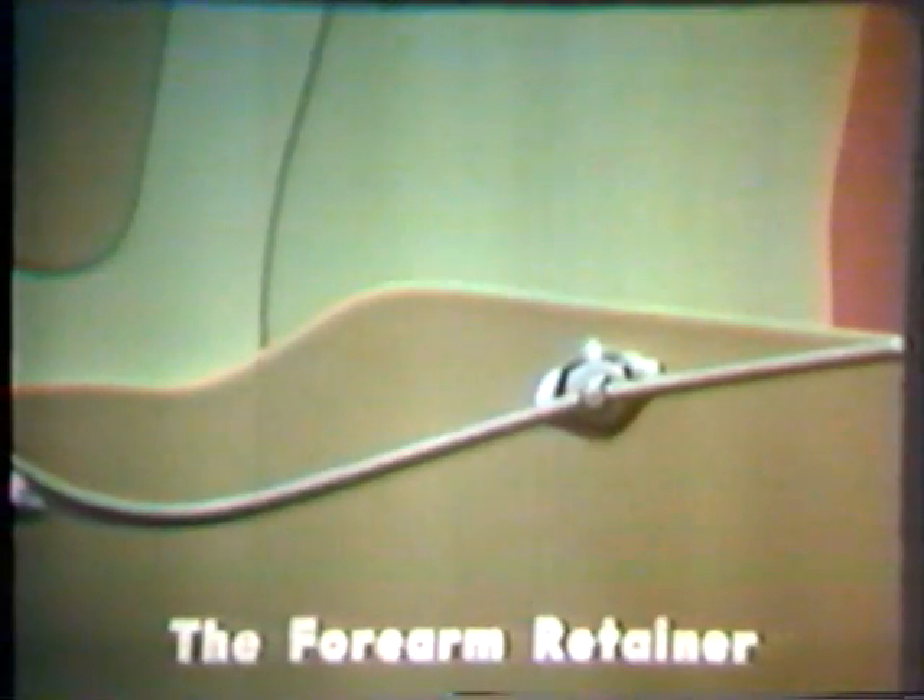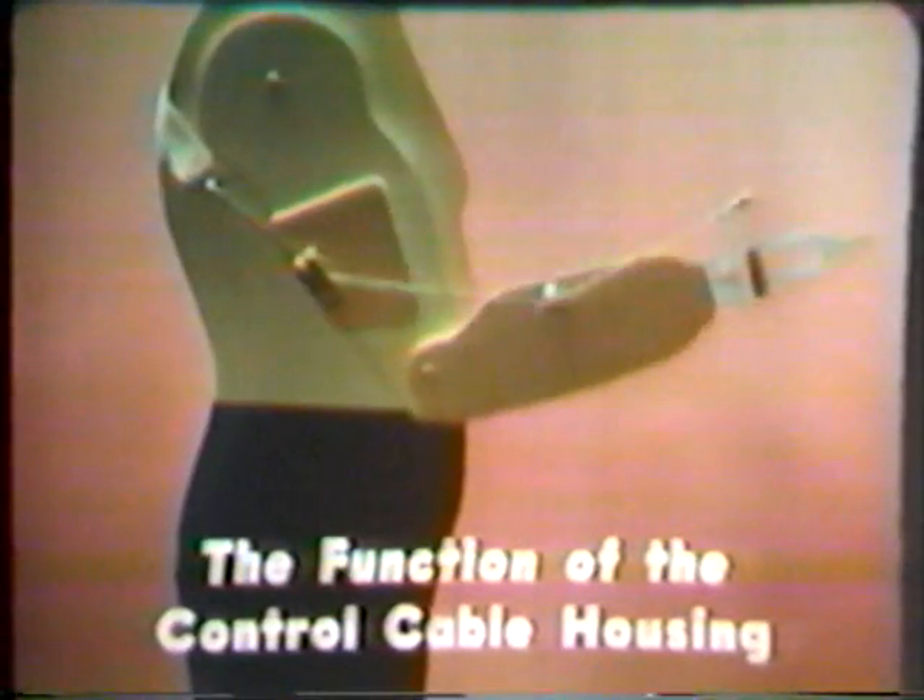The housing passes near the elbow joint and is attached to the forearm by the forearm retainer. The housing terminates distal to the forearm retainer. The control cable originates at a metal hanger which is attached to the harness. The cable enters the proximal part of the housing above the crossbar assembly, passes near the elbow joint, leaves the housing distal to the forearm retainer, and terminates at the operating lever, or thrum, of the terminal device.